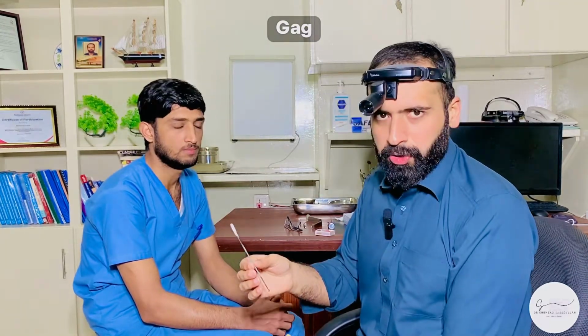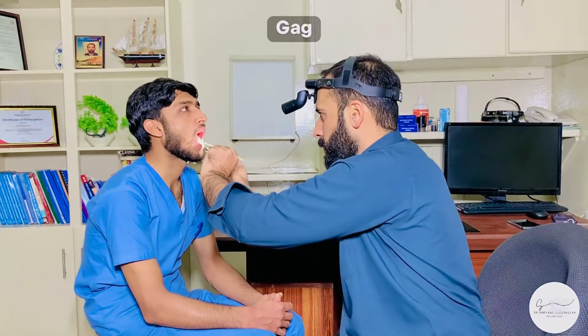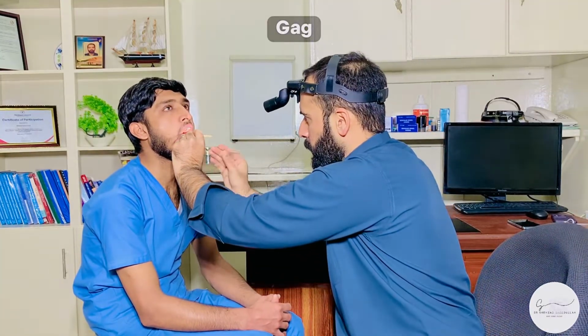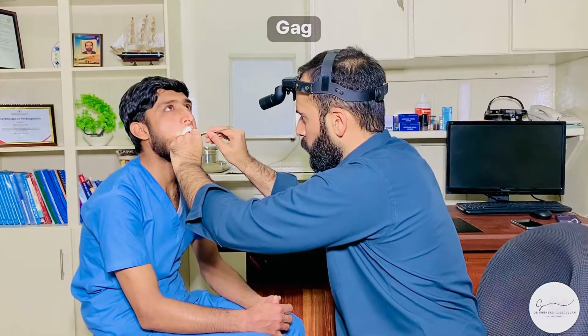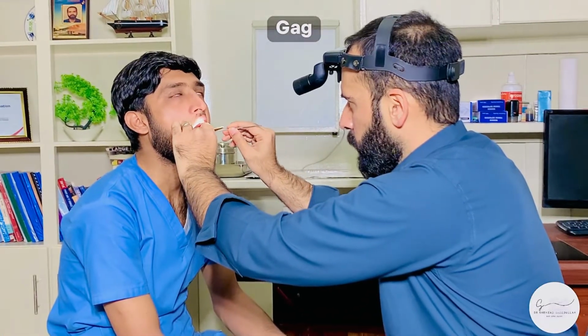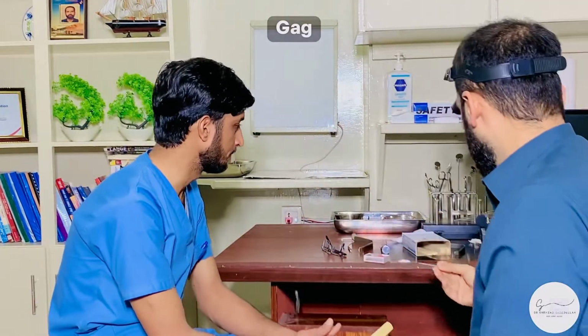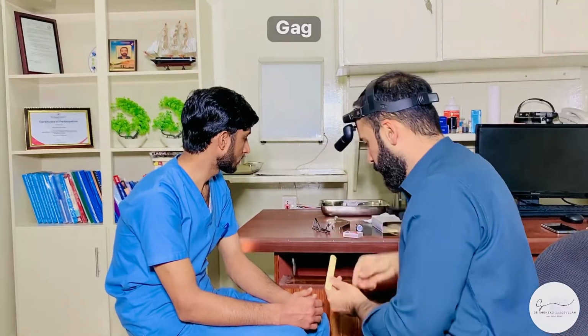So the way of checking gag reflex is, again, you will take a cotton swab on a Jobson horn probe. You will turn on the light. You will gently depress the tongue and you are gently going to touch the posterior wall with the swab to see whether the gag is elicited. So first on the left side and then on the right side. So the gag in this patient is intact.